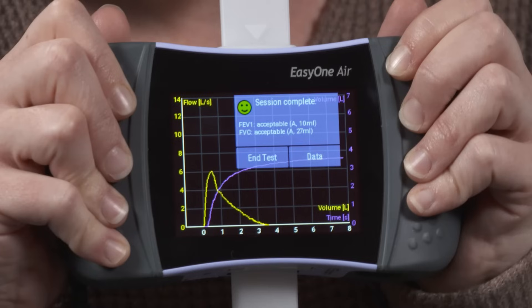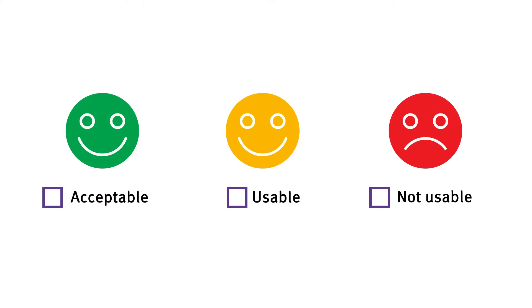During the test, the FVC and the FEV1 parameters are looked at separately and then determined to be acceptable, usable, or not usable. You can click on the stoplight smileys for a detailed look at each part of the trial.